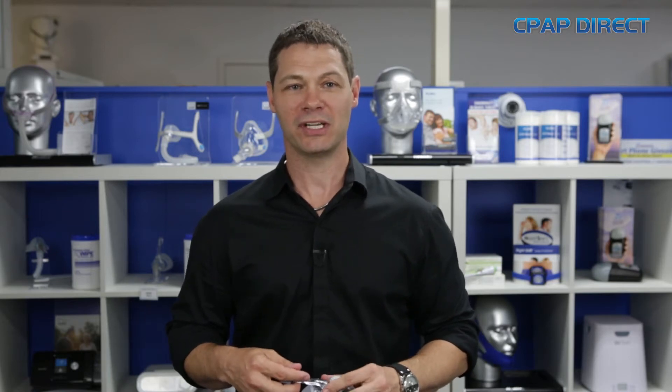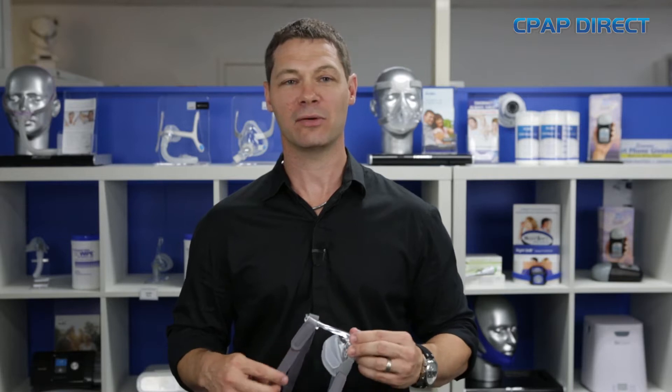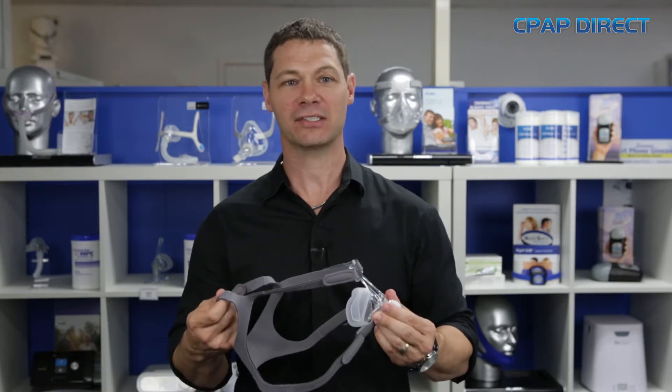Hi, I'm Bryce from CPAP Direct. In this week's CPAP Secrets, we're going to cover how to get the most out of your headgear on your mask.